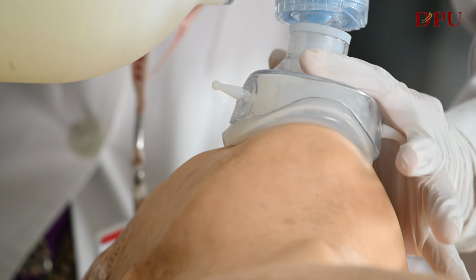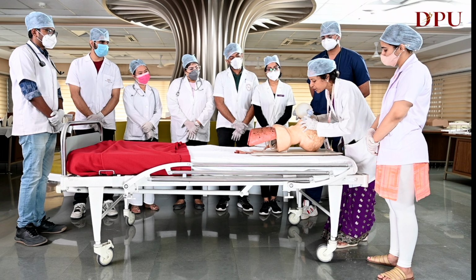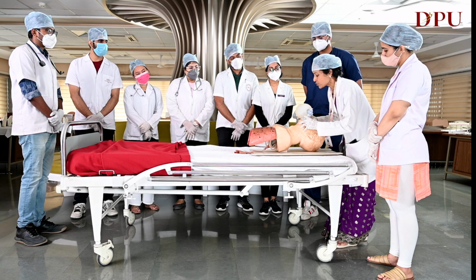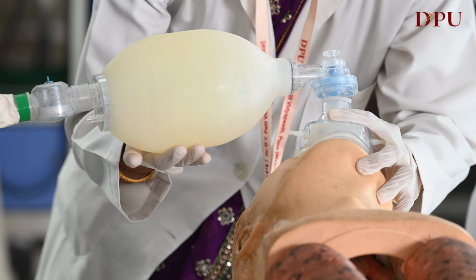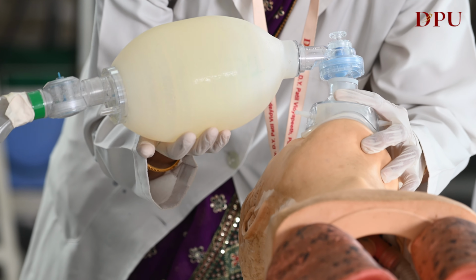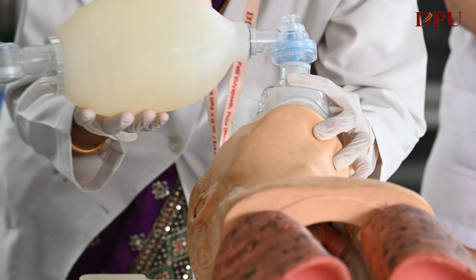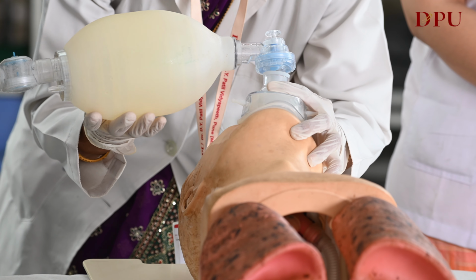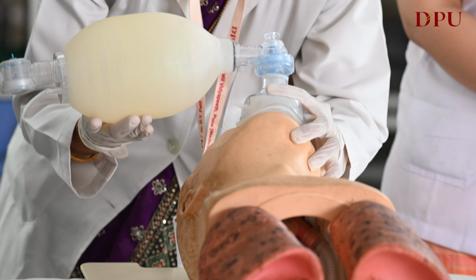With the C, I am going to prevent leakage of the air from the mask, and with the help of the E, I am going to keep the airway open by jaw thrust. So this is the EC clamp technique. Now the other hand is used to inflate. You can see the breath. I am counting 1 1000, 2 1000, 3 1000, 4 1000, 5 1000, 6 1000, breath. At the time of the breath you have to give, so that this becomes the correct respiratory rate for adults, that is 10 breaths per minute.